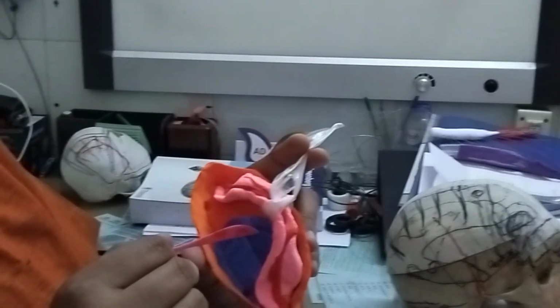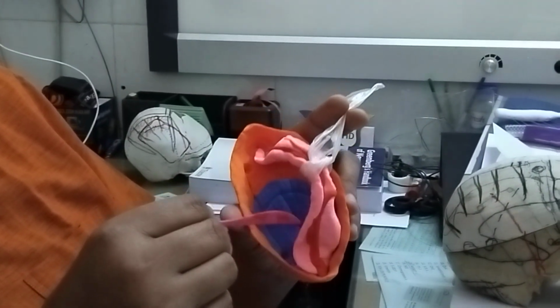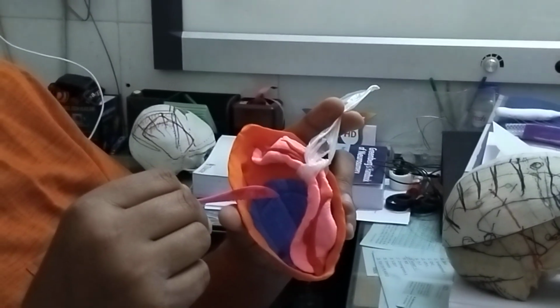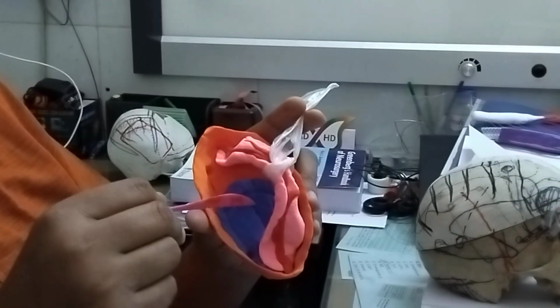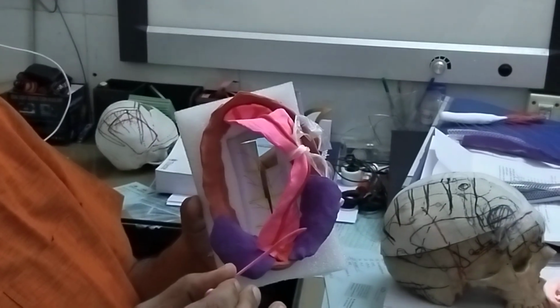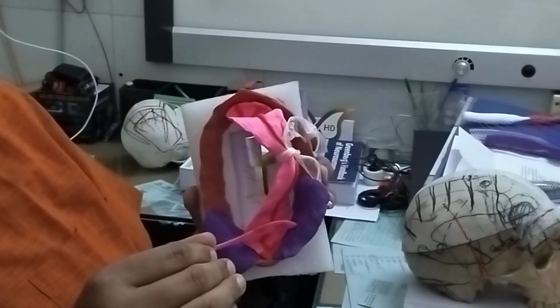By an incision here, we give a midline incision on the temporalis muscle along the course of the superficial temporal artery parietal branch, and elevate the temporalis muscle on both sides and retract it bilaterally with suture material. And this is the temporalis muscle retracted on both sides.